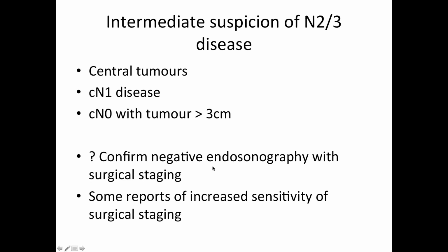Sometimes it might even be that we've already done the EBUS and we've got it negative, and you're still wanting to say, this is a big tumor, the patient's maybe not all that fit, I would like to be absolutely certain. So you do the mediastinoscopy. Others would suggest that we sometimes can get evidence to suggest that there may be increased sensitivity of surgical staging, but the differences are not dramatic. The other systems are very good at this stage.